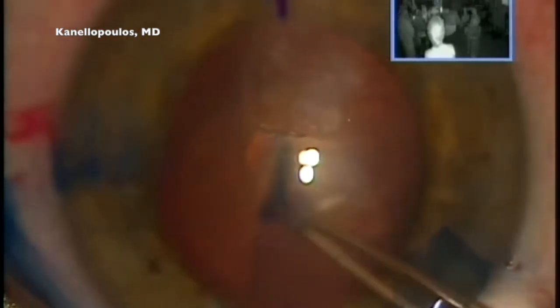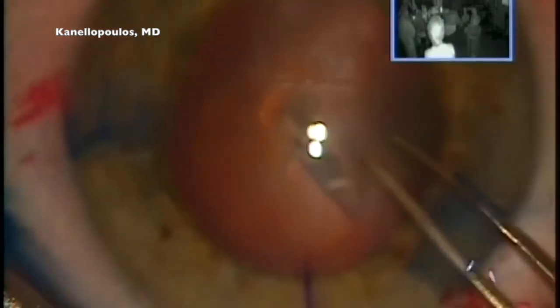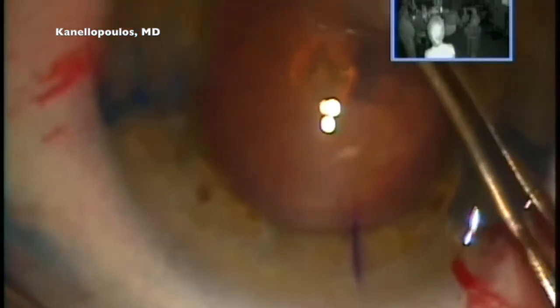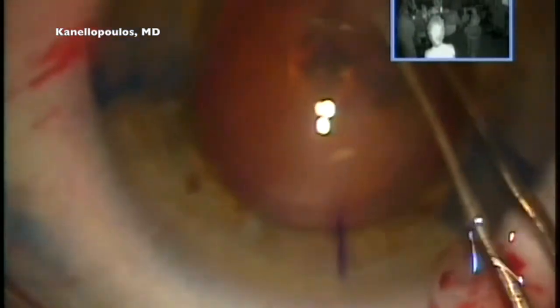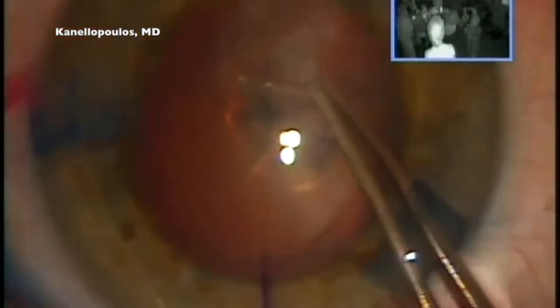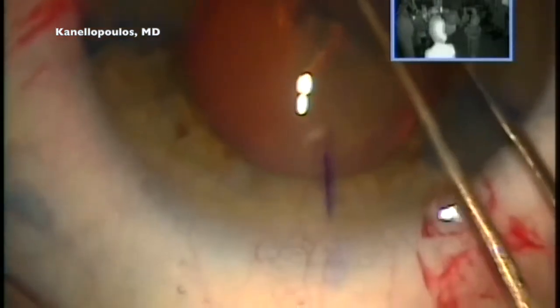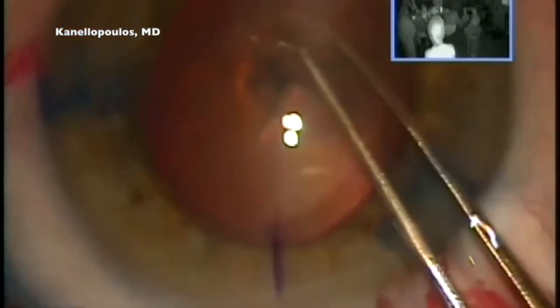This part would be very comfortably performed without the use of dye, and I performed the procedures with a short term peribulbar anesthesia. Use 5 cc's of 2% xylocaine diluted with 5 cc's of balanced salt solution. I'm grasping here, and we're already seeing the difficulty in visualization right under the herpetic scar.